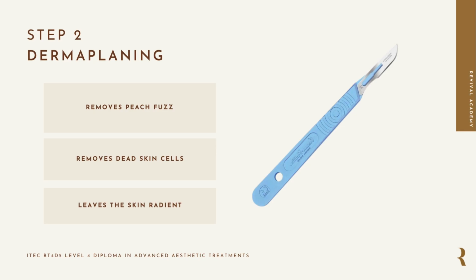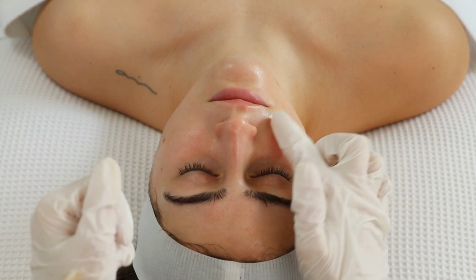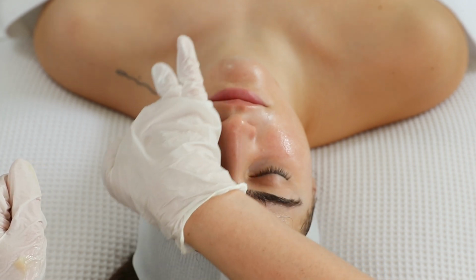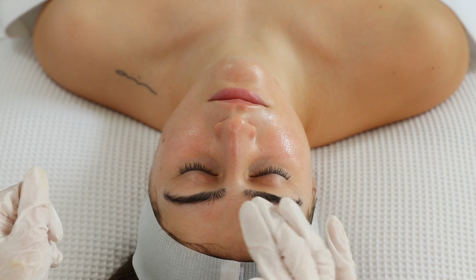After the initial cleanse, we are going to move on to the next step, which is to carry out the dermaplaning treatment. Before you begin, you need to take a pea-sized amount of dermaplaning balm and apply it evenly all over the skin. Using the balm helps you glide better with the blade and minimizes any chance of cutting through the skin and leaving a graze.